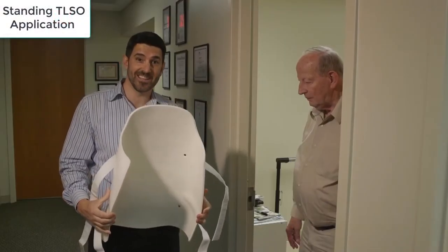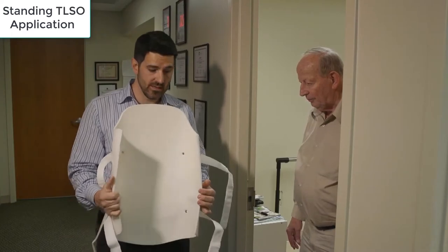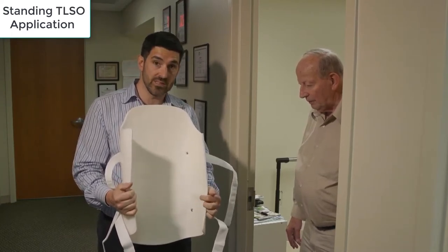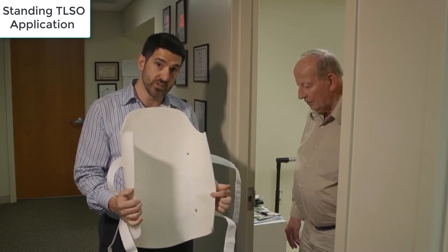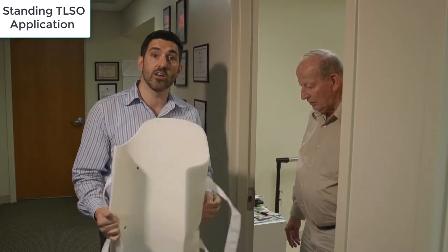Here's the posterior panel of the TLSO, and what I'm trying to show everyone watching is that in almost every TLSO I've ever seen, there is a padded waist groove. Some are bigger, some are smaller, but there's always a groove there, and it's there on purpose.